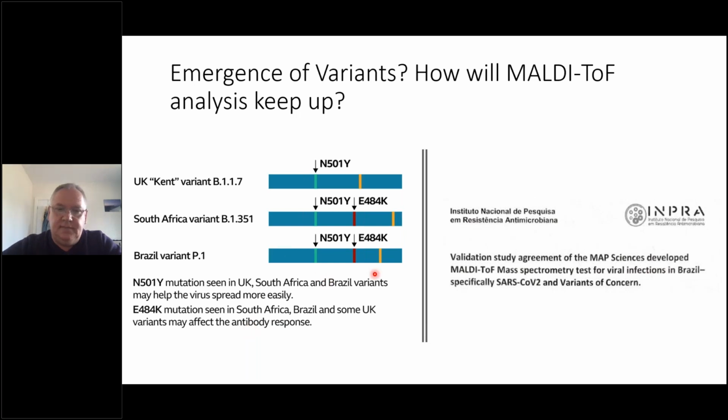Now, we have recently entered an agreement with a fantastic team in Brazil, and we're just about to start our study using the developed MALDI-TOF mass spectrometry test for this viral infection in Brazil. With this group, we are going to be looking to see how different the spectra are with these variants of concern, in particular the P1 variant.